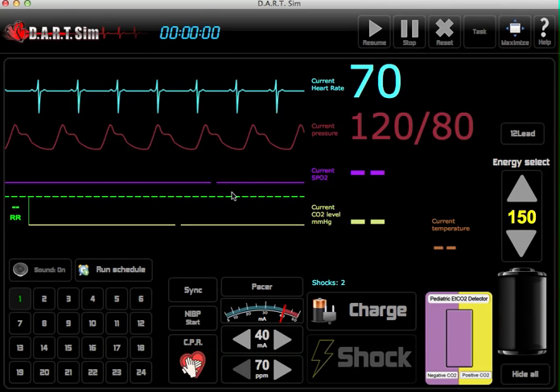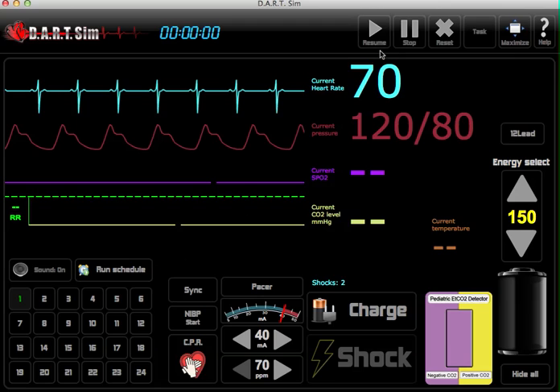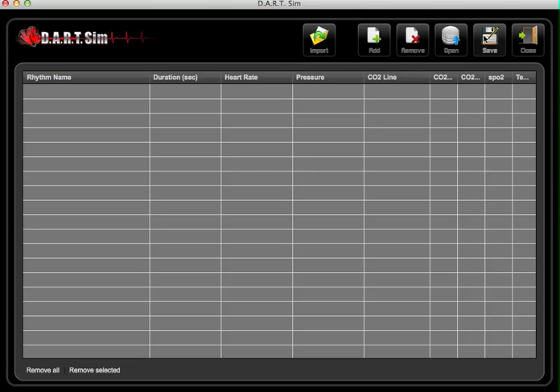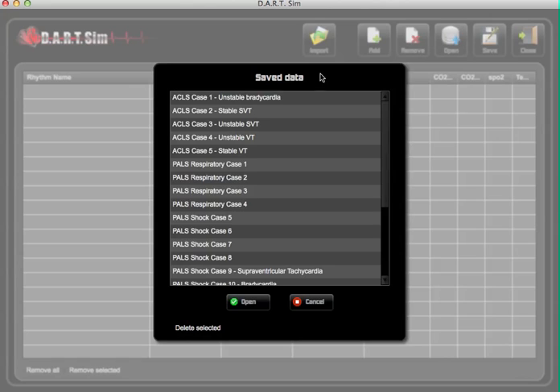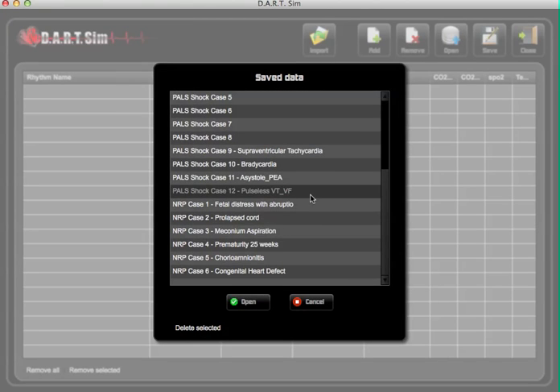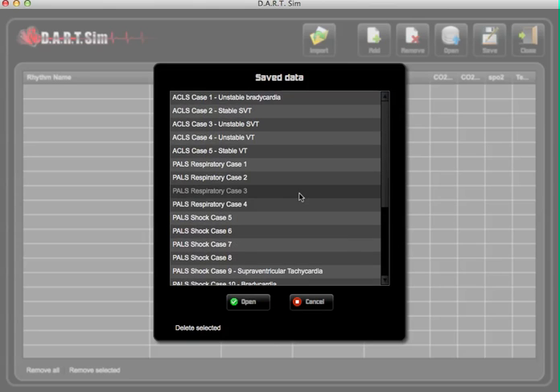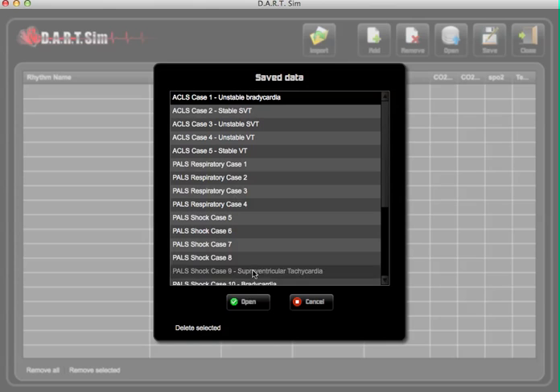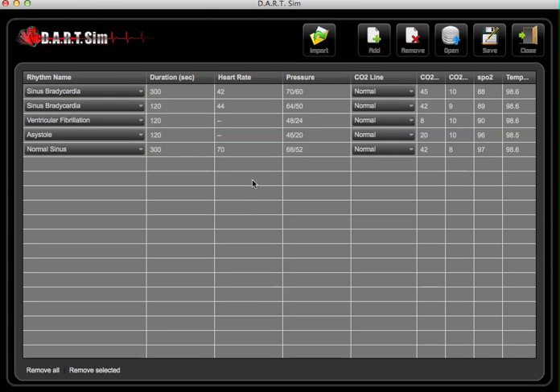This is operating the DART Sim in what we call manual mode. If you want to run one of our custom scenarios, just go to our task button up here, then go to open — we already have all the ACLS, PALS, and NRP cases loaded. All you have to do is choose your case, open up your case, and this is how your scenario is going to run out.